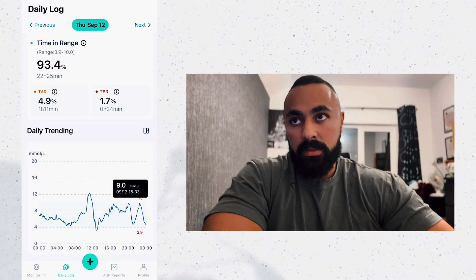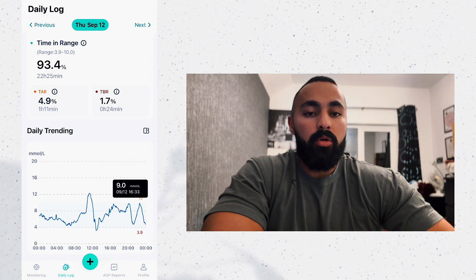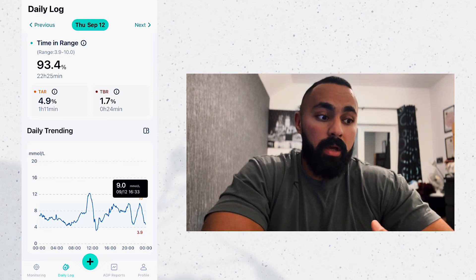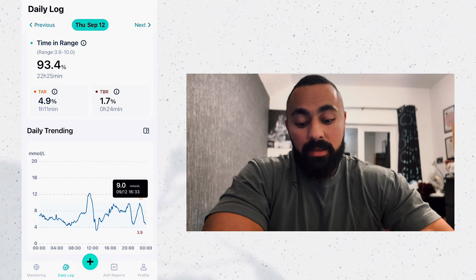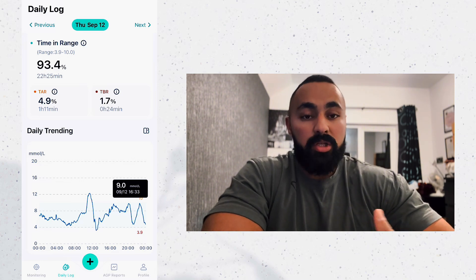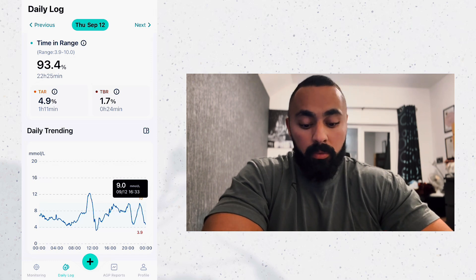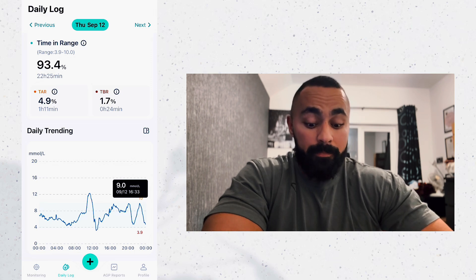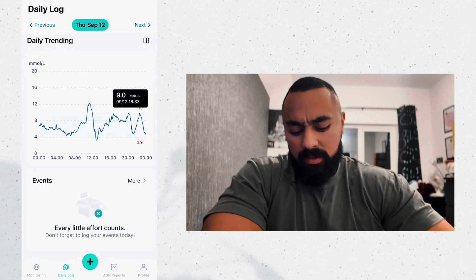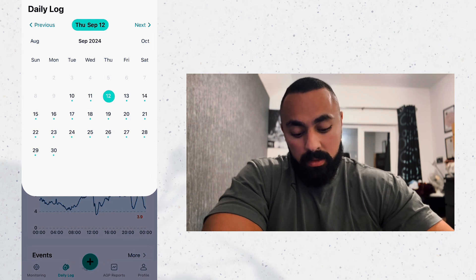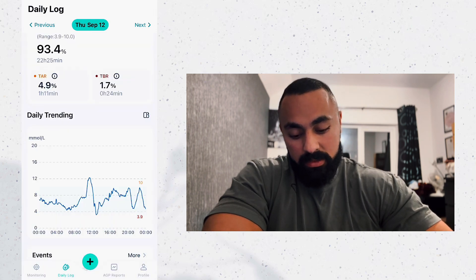These metrics are actually very important for your physician, coach, or nurse — they show what you need to work on. For example, if your time above range is 20 or 30%, you know you've got an issue with hyperglycemia. You need to think: am I taking the right background insulin, the right amount, the right type? Do I need to change my diet or exercise more? Similarly, if time below range is high, it means you're going through a lot of hypoglycemia, which messes up your diet. So it's a very important metric.